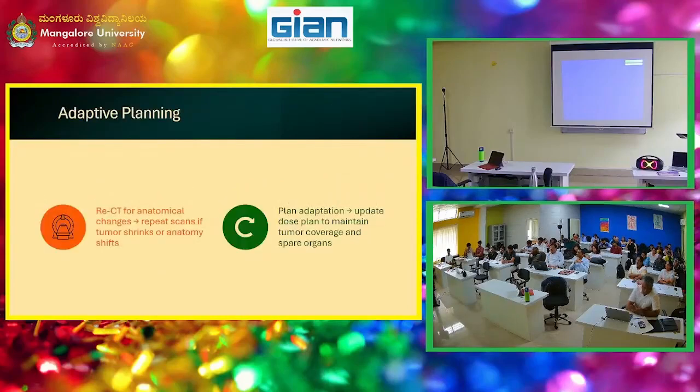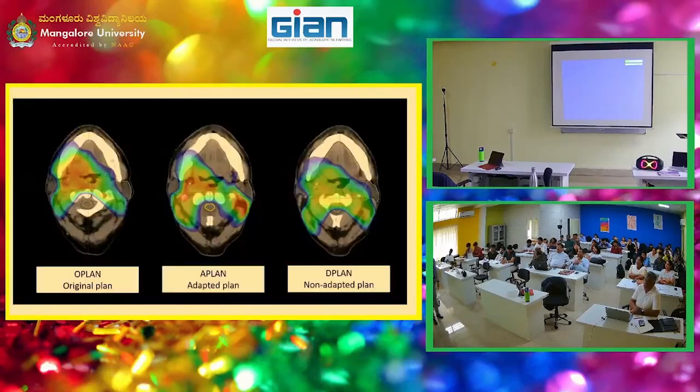Okay, so last thing, of course, things change, and we talked about that. So what's adaptive planning? I think it's the next one, yeah. Adaptive planning means, oops, the patient's changing. So what happens is they get scanned again, you do it all over. That's all it is, really.